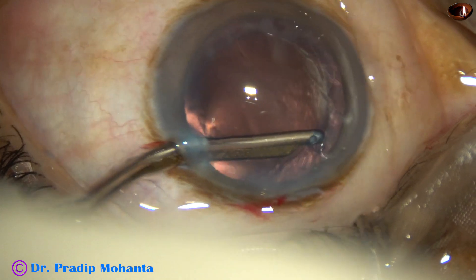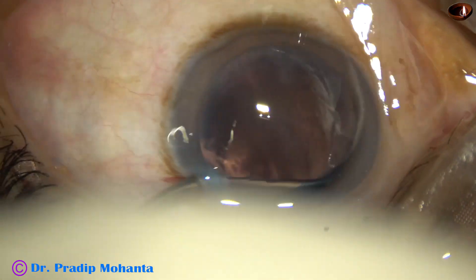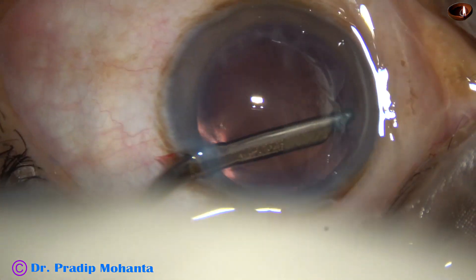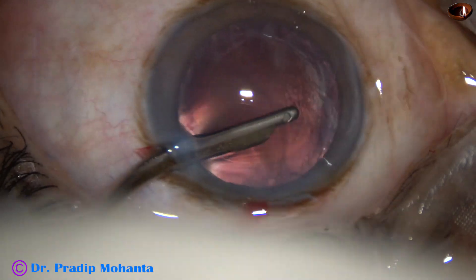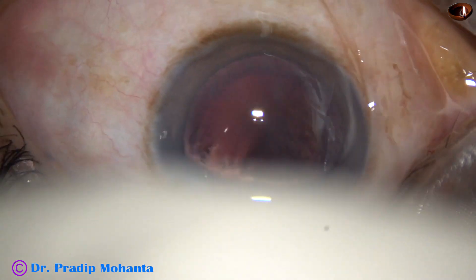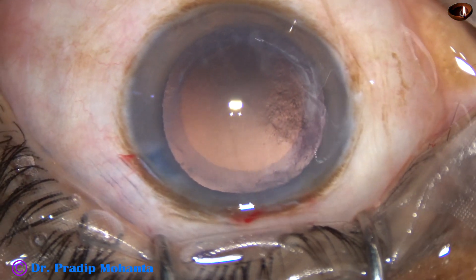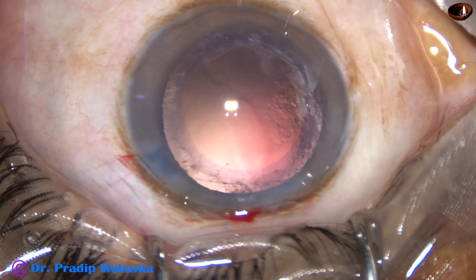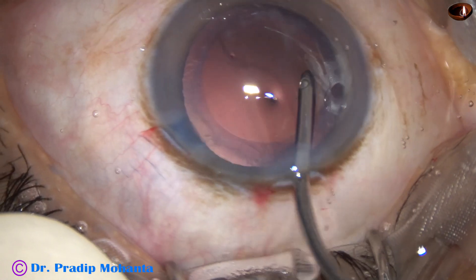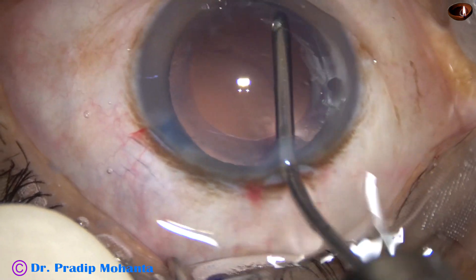When the main incision and the side port incisions are about 3 clock hours away, astigmatism produced or induced by the main incision is neutralized to some extent by the side port if the side port is a little large. So in this case the side port is a little large and hopefully it has neutralized the astigmatism that has been induced by the main incision.